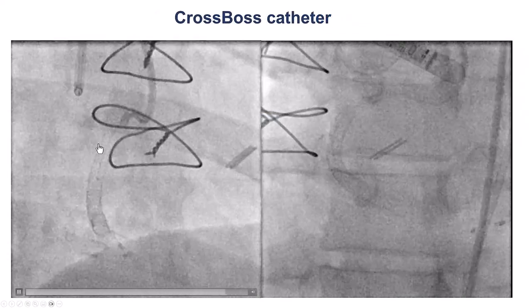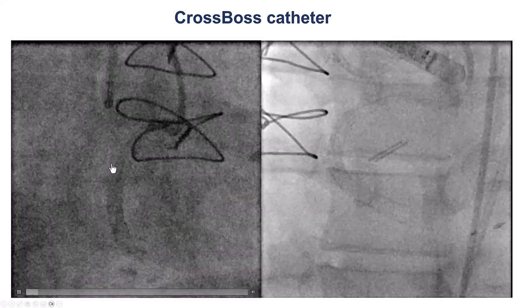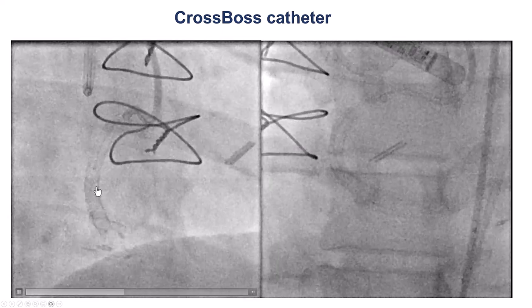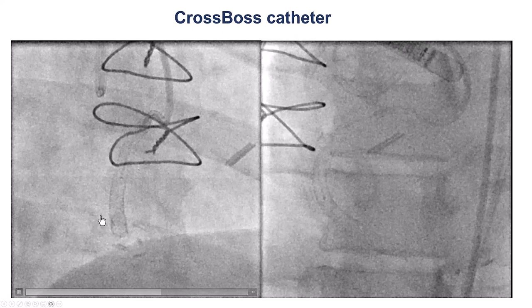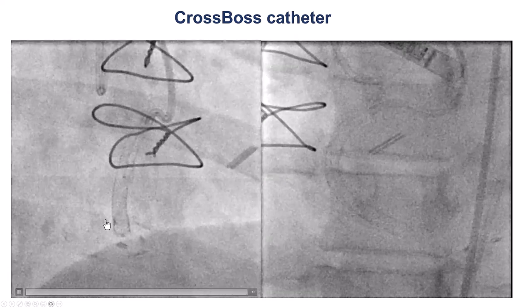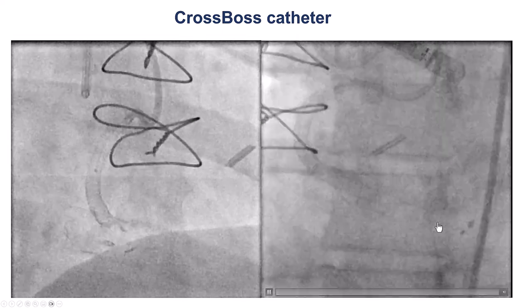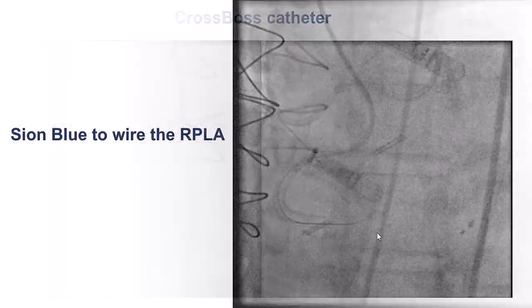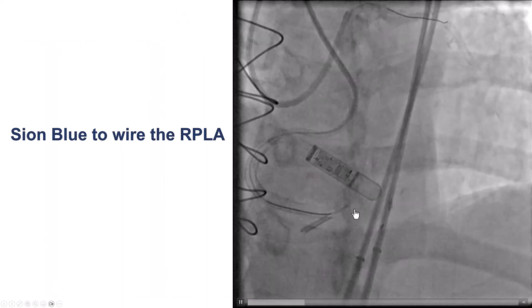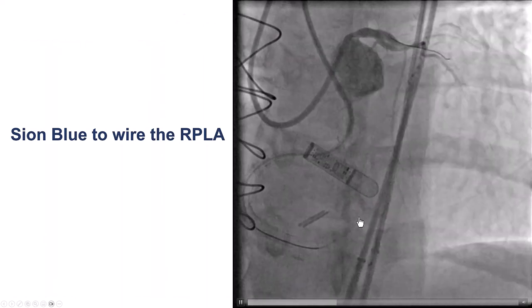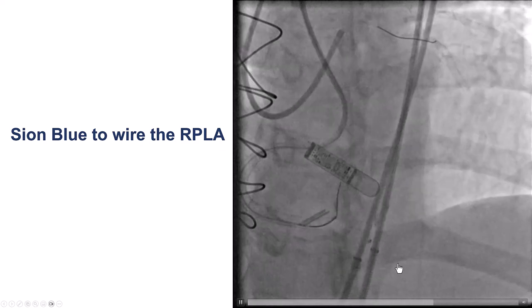In this case, we did use a CrossBoss catheter, which is something we don't routinely do. However, it can shorten the time it takes to cross in CTO. And sure enough, fairly quickly, the CrossBoss successfully crossed all the way into the distal true lumen, as confirmed by contralateral injection.